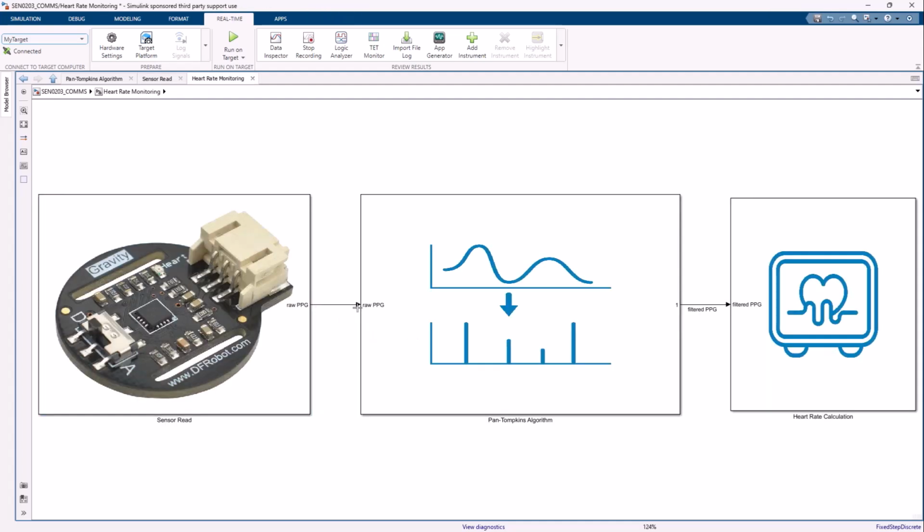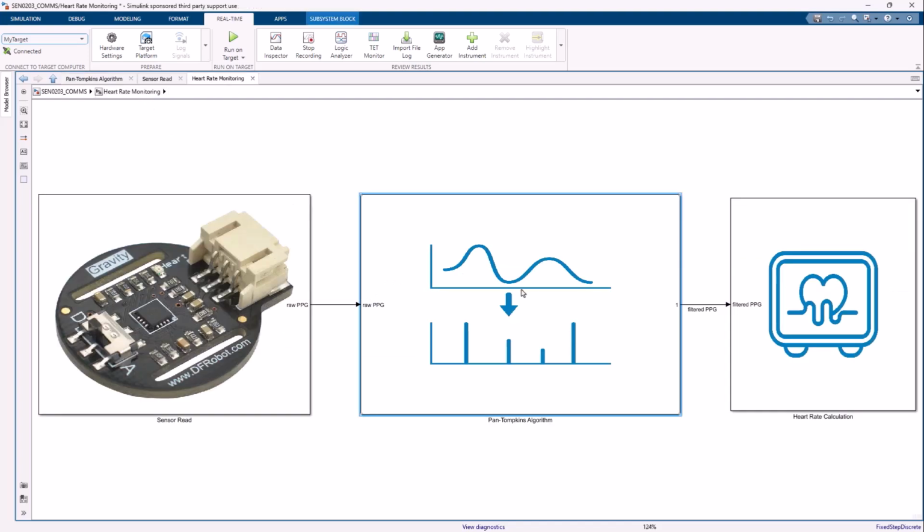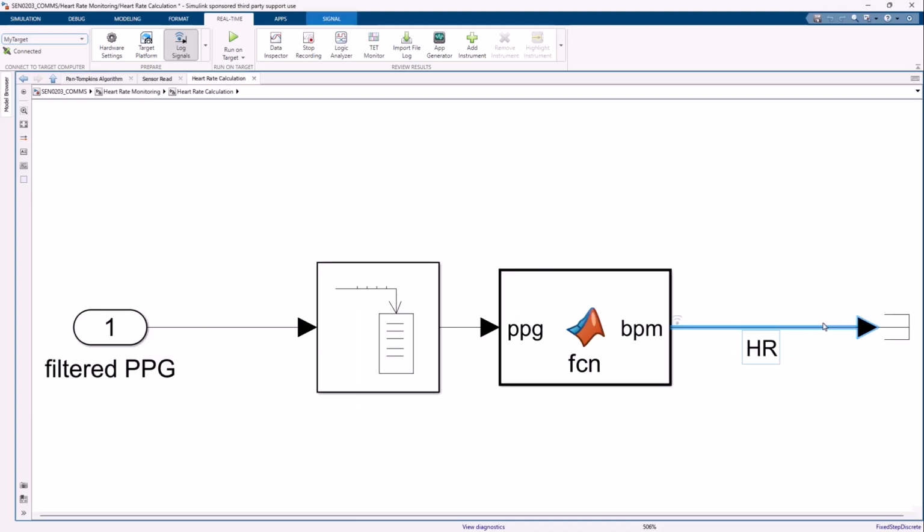We can go on to process it so we can calculate the heartbeat. We are going to process it using an adapted Pan-Tompkins algorithm, as you can see here, which applies some filters, squaring, and then an integrator to smooth out the signal and isolate the peaks. And then we can just use a thresholding method to identify the peaks which correspond to the individual heartbeats. As you can see, these blocks are readily available, so you can quickly implement the algorithm of your choosing.